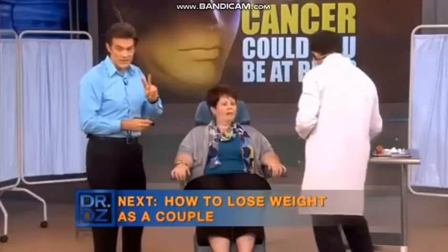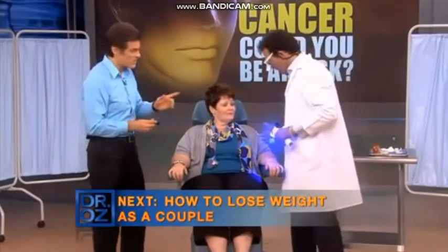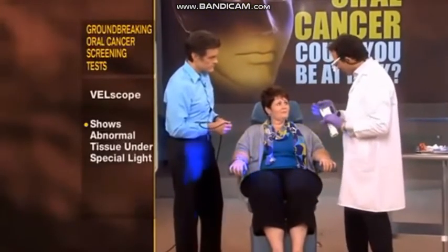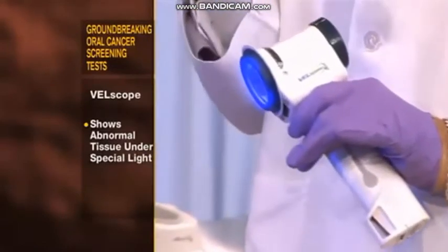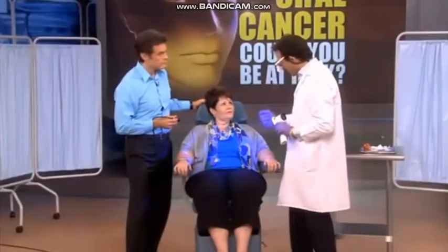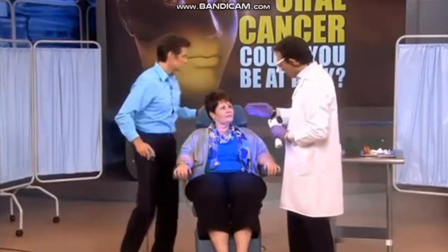We've got two technologies that are changing dramatically how we can quickly screen and identify cancers. This thing is really cool. So the VELscope is a new technology, and it's a visualization tool, and it allows us to see the normal tissue and compare it if there's any abnormal cells. And it will highlight these abnormal cells early when it's dysplastic changes. What that means is when the cells are just changing from healthy to unhealthy.